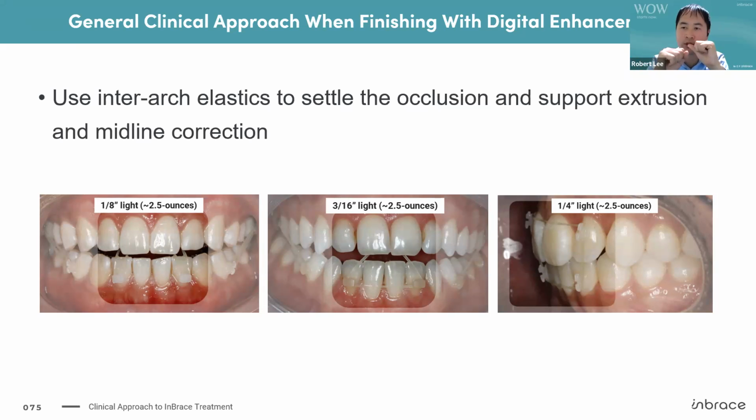Once you have it pulled and stretched out, you just slide it under the IP loop of the upper ones, and then you just bring it down to the lower 2 buttons. Even after I've shown every patient how to do it, sometimes it slides out. The first couple of times they try to slide it under, they miss. But everyone is able to do it within a minute.